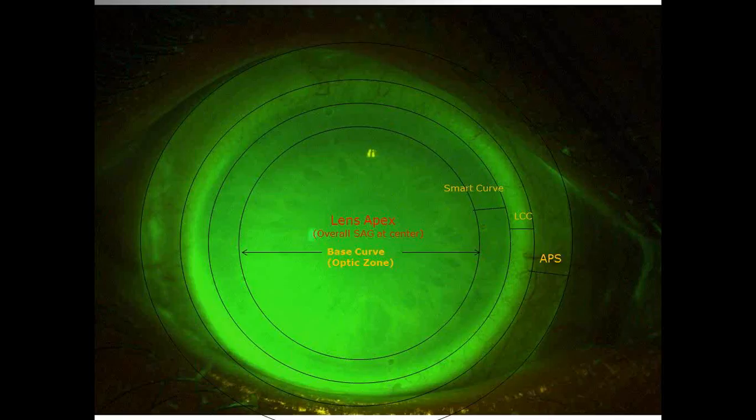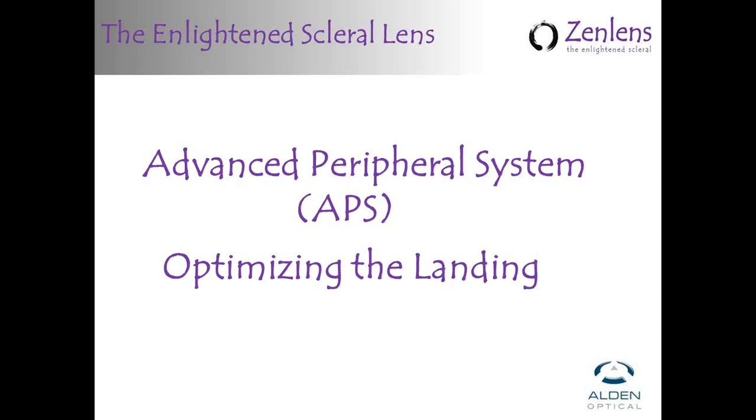Yeah, that's a great point, because I've seen pictures that have been sent where in a head-on shot like this, it looks like you have touch, and then they submit an OCT scan that shows that there actually is clearance. It's just less clearance than what is around it, and so that's that fluorescein thinning. Sometimes it looks like touch. So the Wratten filter, very good idea.